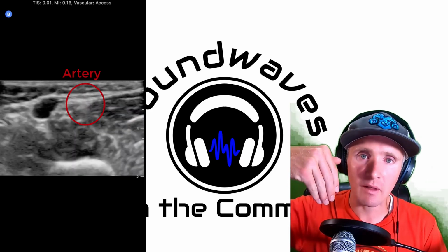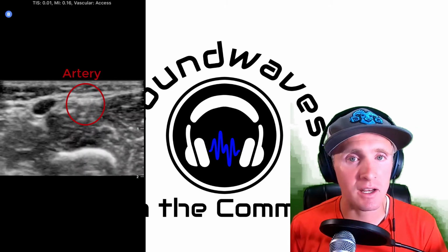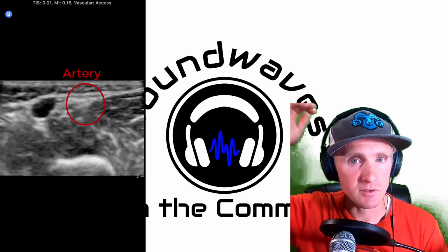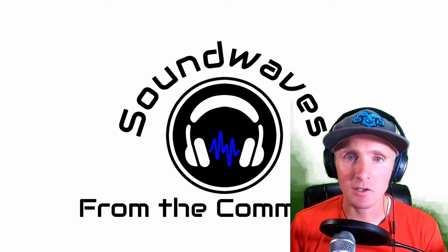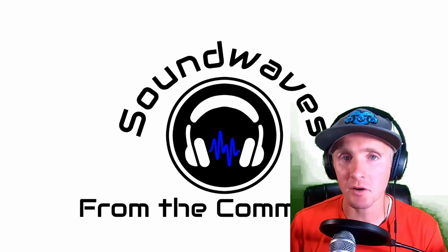But when you're putting pressure down to confirm artery versus vein, put pressure down slowly and then hold it. When you get the vessel halfway collapsed, just look at it. If it's pulsating, it's not a vein, it's an artery. If you just hammer up and down, there's no way you're going to see the pulsations, and you're not going to be able to see if it's an artery or vein. So I'd recommend going slowly, get it halfway collapsed, and look if it pulses. A lot of times you're going to see the veins right next to an artery, so if you see a cluster of anechoic structures, the ones that collapse first are going to be the veins.